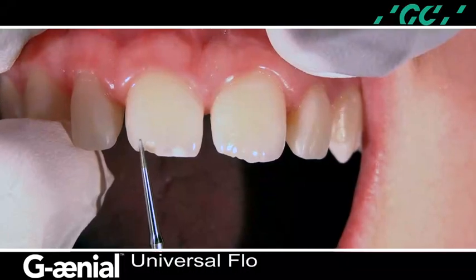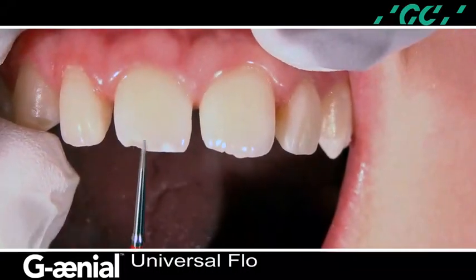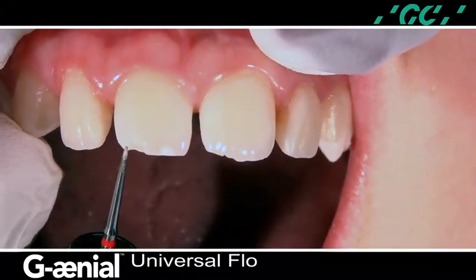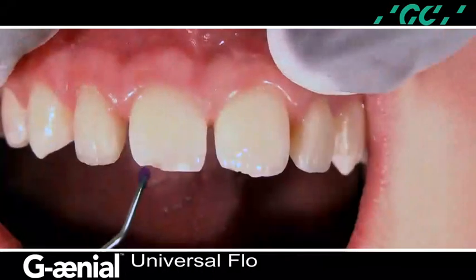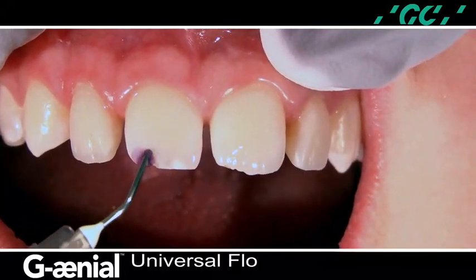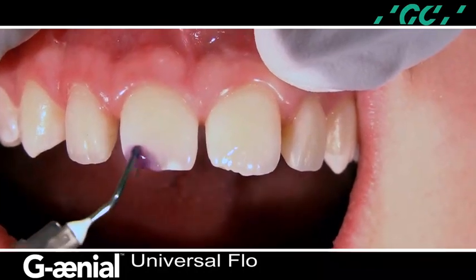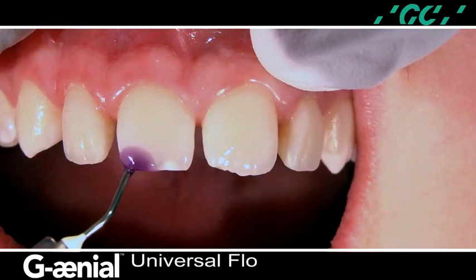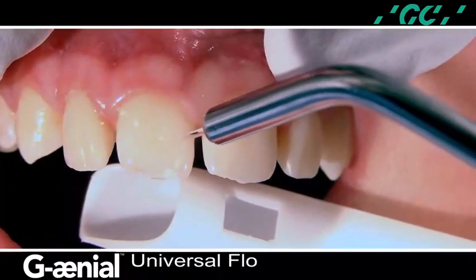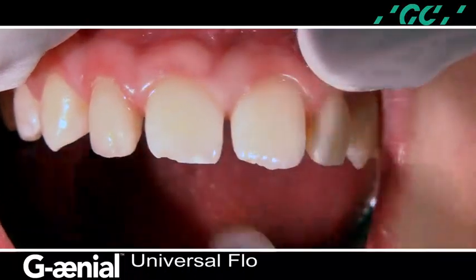A scalloped chamfer preparation is placed several millimeters in depth around the entire cavity using a 30-micron tapered diamond burr, a DET3 by Brasseler. A 37.5% phosphoric acid semi-gel etchant by Kerr was placed on the preparation and several millimeters beyond the anticipated restorative margin for 15 seconds, rinsed for 5 seconds, and air dried with an 8X warm air tooth dryer for 5 seconds.